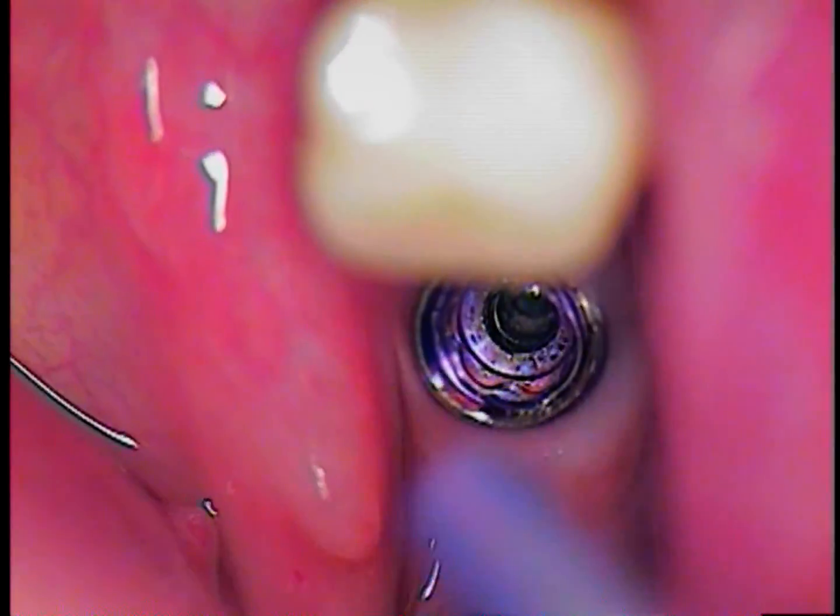In my office I have a total of five dental microscopes, one of which I borrow for the school. I actually use one over at the Florida Atlantic University when I teach on Fridays.